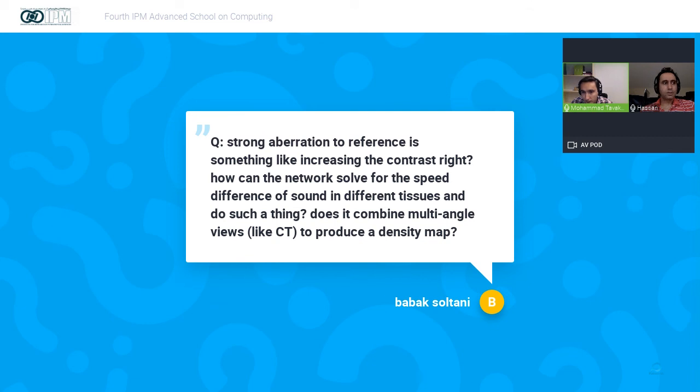So basically what we do in ultrasound is that we try to focus at a point. If I use this remote as an ultrasound probe, we have a lot of small ultrasound crystals at the bottom of it, and with each one of them we receive one RF signal, right?